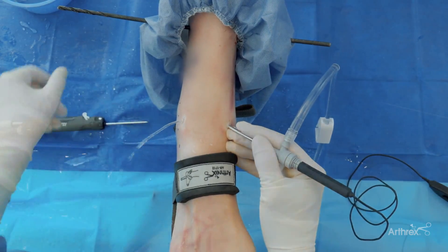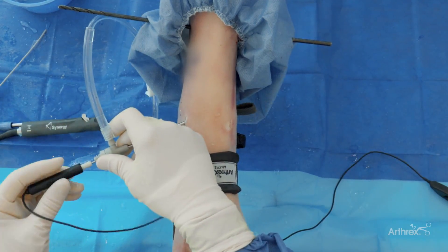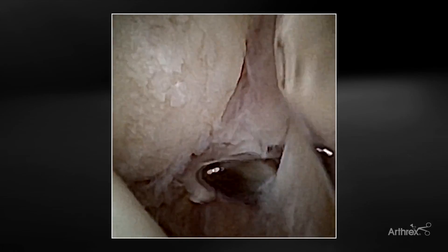This is actually being used all over the body — it's fascinating where they're starting to use this, in the hand and wrist and even outside of orthopedics. Here's the medial side, the medial gutter. You can come down and see that the deltoid has been disrupted here — the anterior cuff. In a chronic setting you'll usually see it's avulsed off of the bone, with chronic changes through here. Sometimes you'll even see the posterior tibial tendon. Come and document your deltoid, especially on ankle instability patients. Once you look and see normal, it's so much easier to see pathologic.